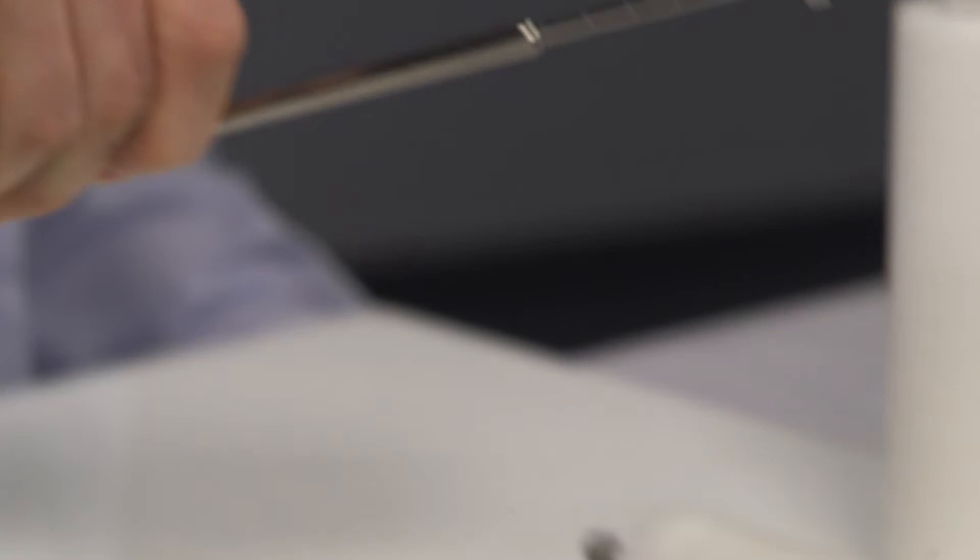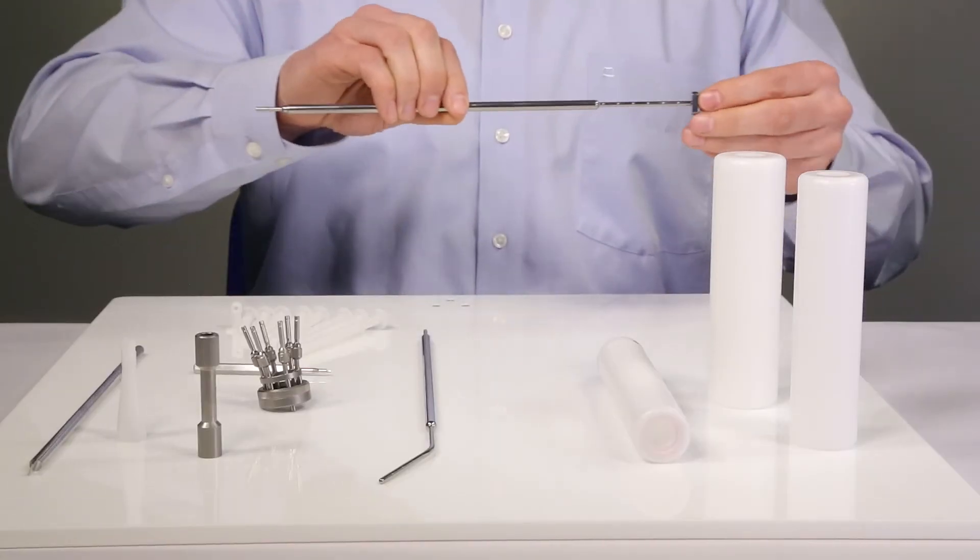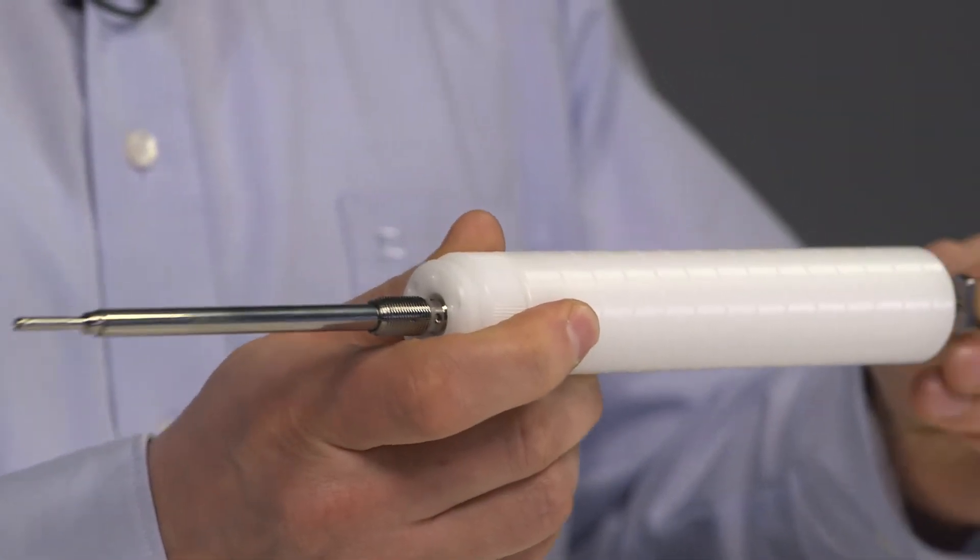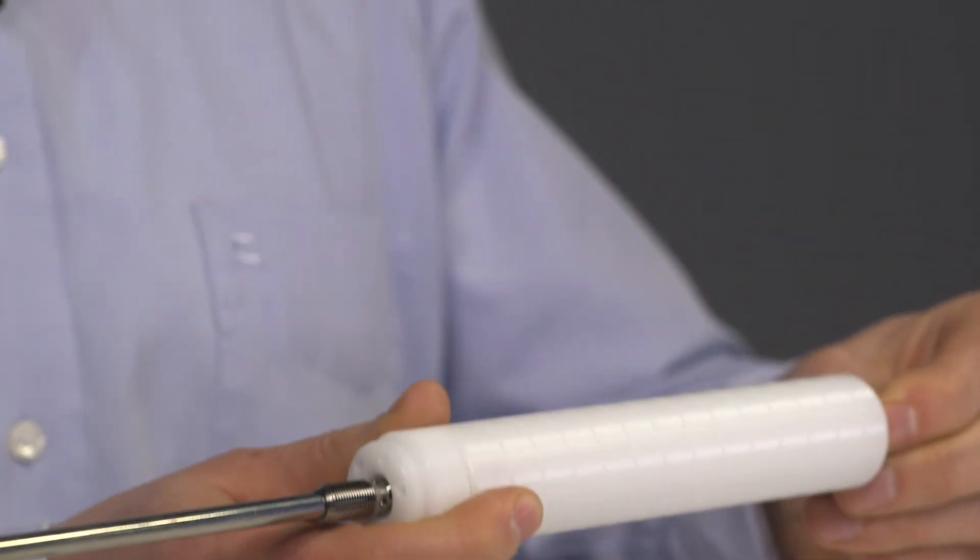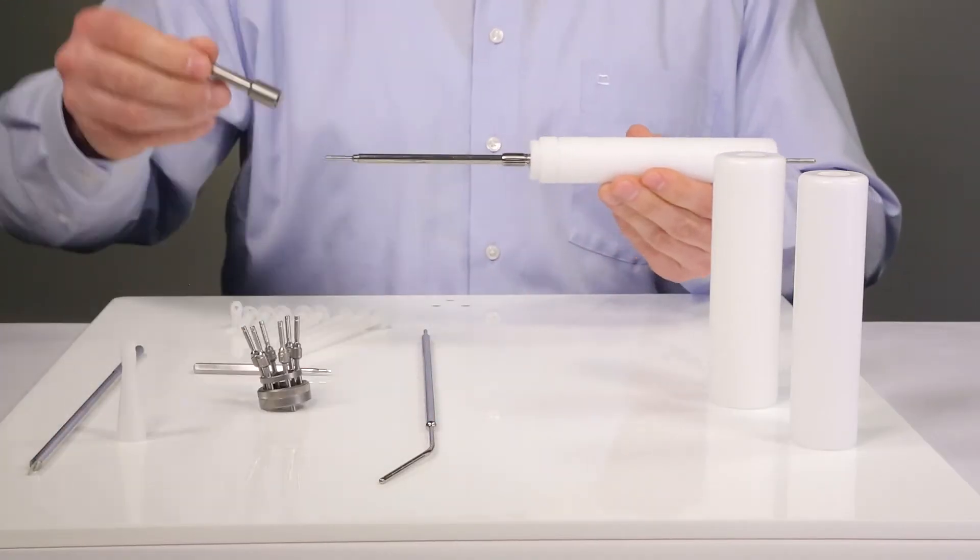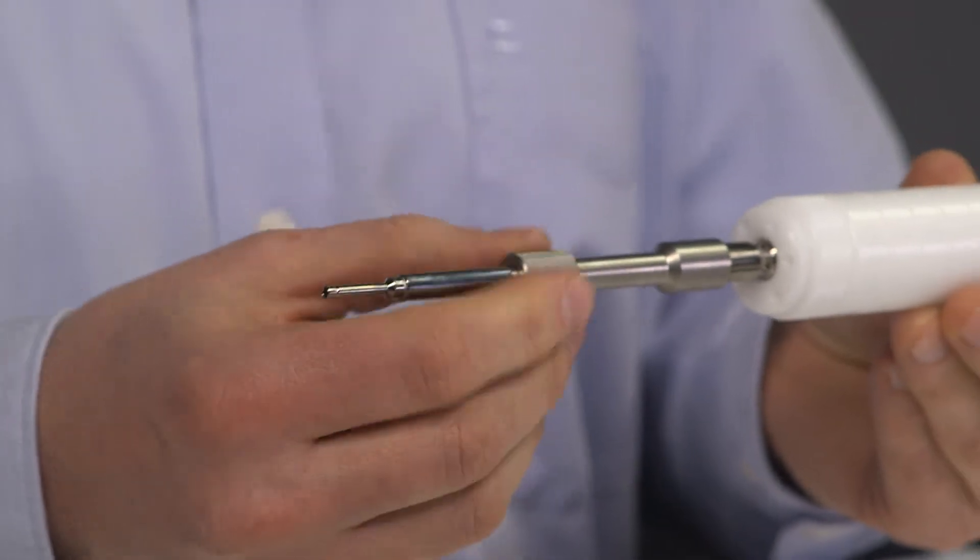Once the IU tube is inserted, the applicator can be pushed over the IU tube until it reaches the cervix. It is fixed with a tandem lock knob.